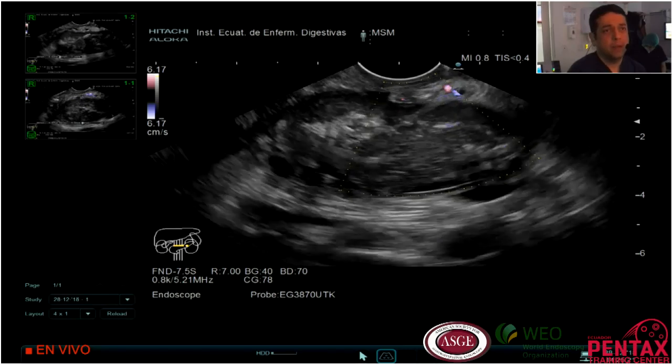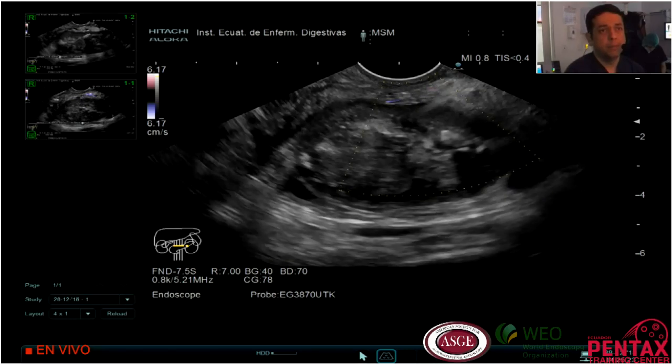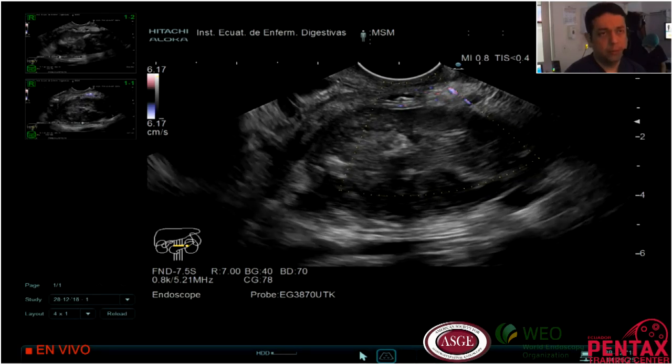Why? This will help us first to go in the correct way, trying to avoid the vessels, and this will help us to avoid a complication such as bleeding.